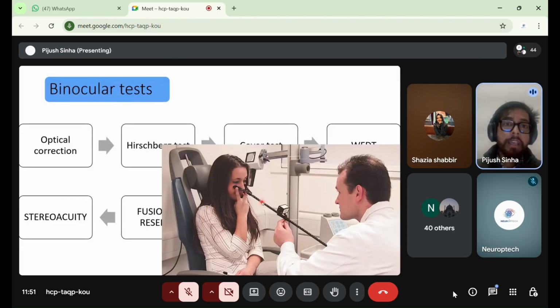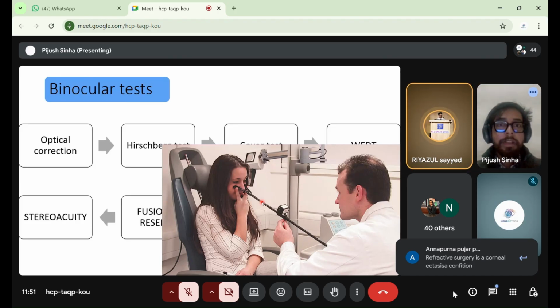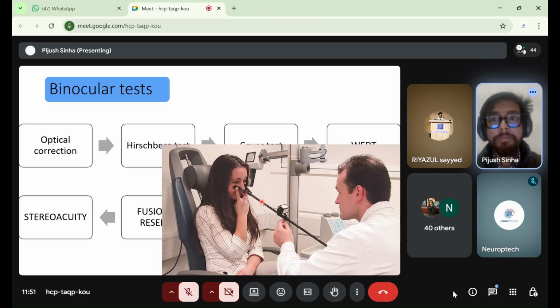And yeah, suppose I did the Scheimpflug imaging or Pentacam for one patient and found the Belin Ambrosio map showing some yellow spot. I do not stop myself at only one reading. I take three readings to see whether it is correctly taken or not. Even when the QS value is okay, after three readings I confirm which is the best and not showing the abnormality, because I also don't want the patient to get sad. That's why, take three consecutive readings and go for the best one.